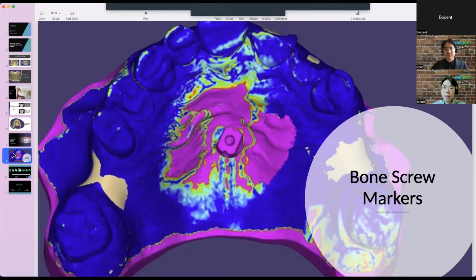Yeah, so this is the issue. The common problem that we have, which delays the turnaround time, is the wrong scan file or misaligned files. So please make sure that it has been saved with the correct coordinates of the scan file. Send it to us, and then we can directly proceed to design. For example, per arch, we can get back to you in less than an hour.